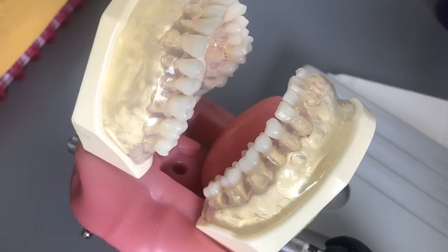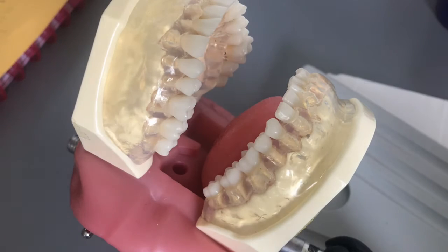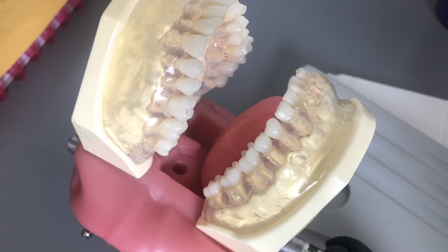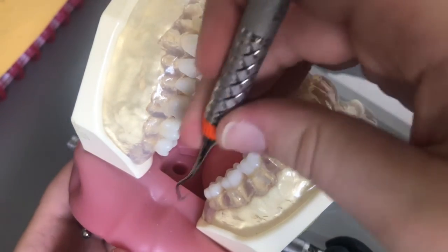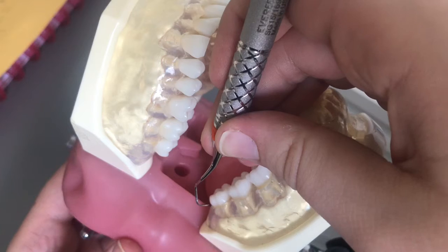All right, and I'm on my fourth and final section doing the right mandibular facials. And I don't know if I mentioned while doing the left maxillary linguals or not, but I am in an 8 to 9 o'clock position while doing this surface and the surface I had done before. All right, I'm gonna start on the most distal tooth.